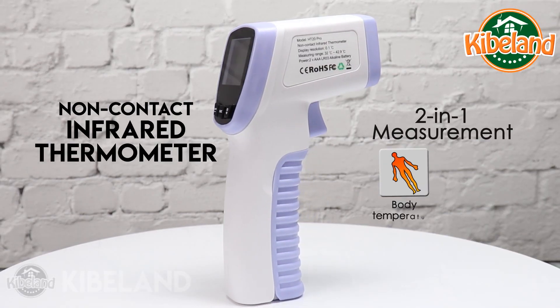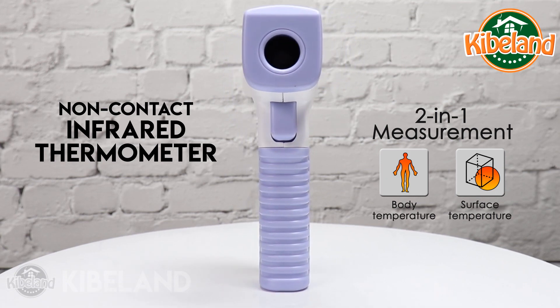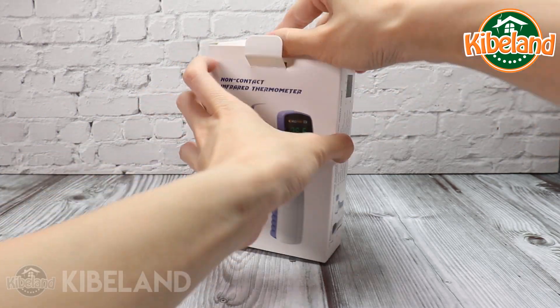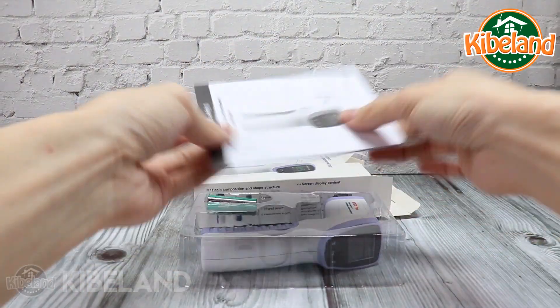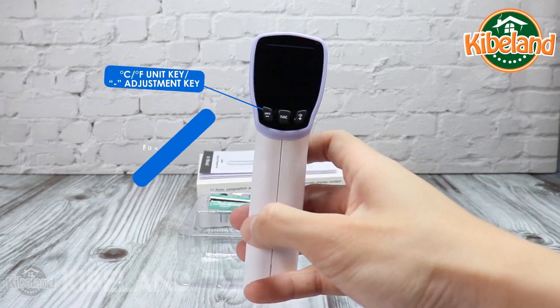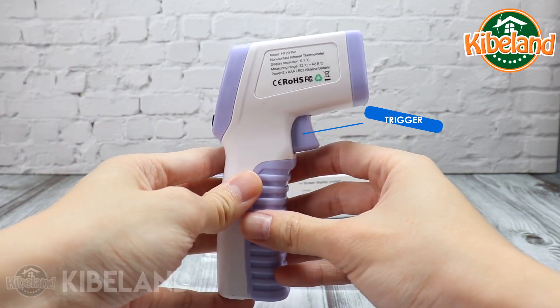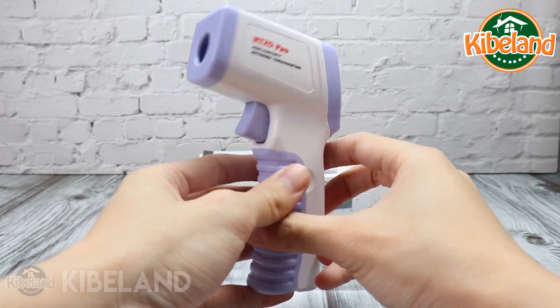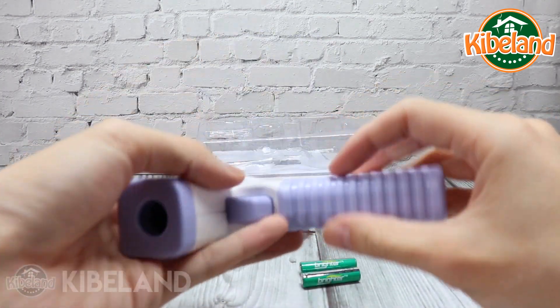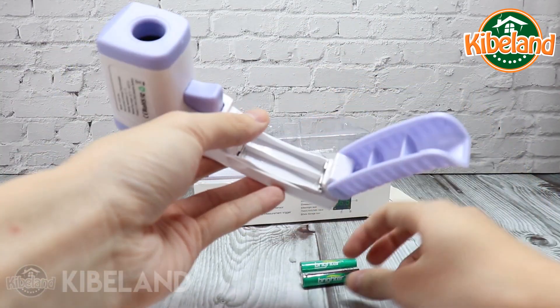This HT20 is a 2-in-1 body and surface non-contact thermometer. To operate, open the battery cover and load two triple-A batteries.